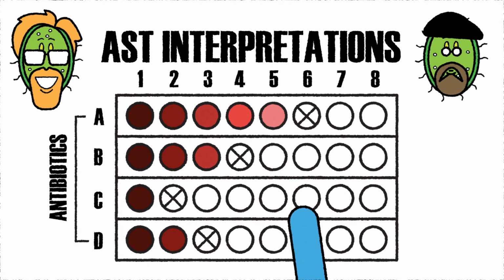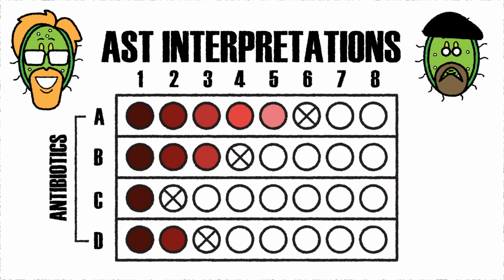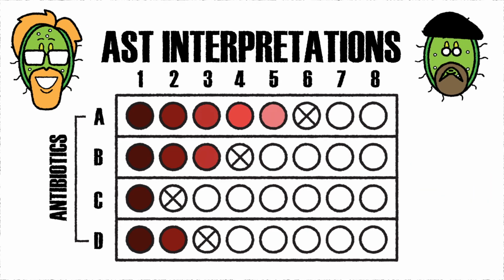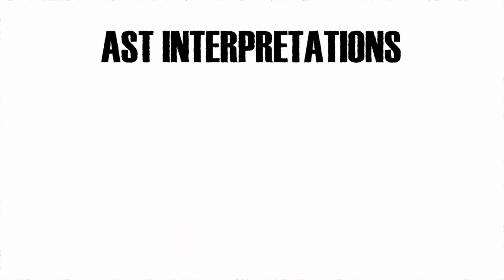Time to bust a common myth. Don't compare MICs between antibiotics. We don't use the same milligram per kilogram dose for all antibiotics, so of course the concentrations of drug in the serum are different for different drugs. AST panels test concentrations of drugs achievable in the body after oral or parenteral administration. This means that MICs should only be compared to the breakpoint of that antibiotic.